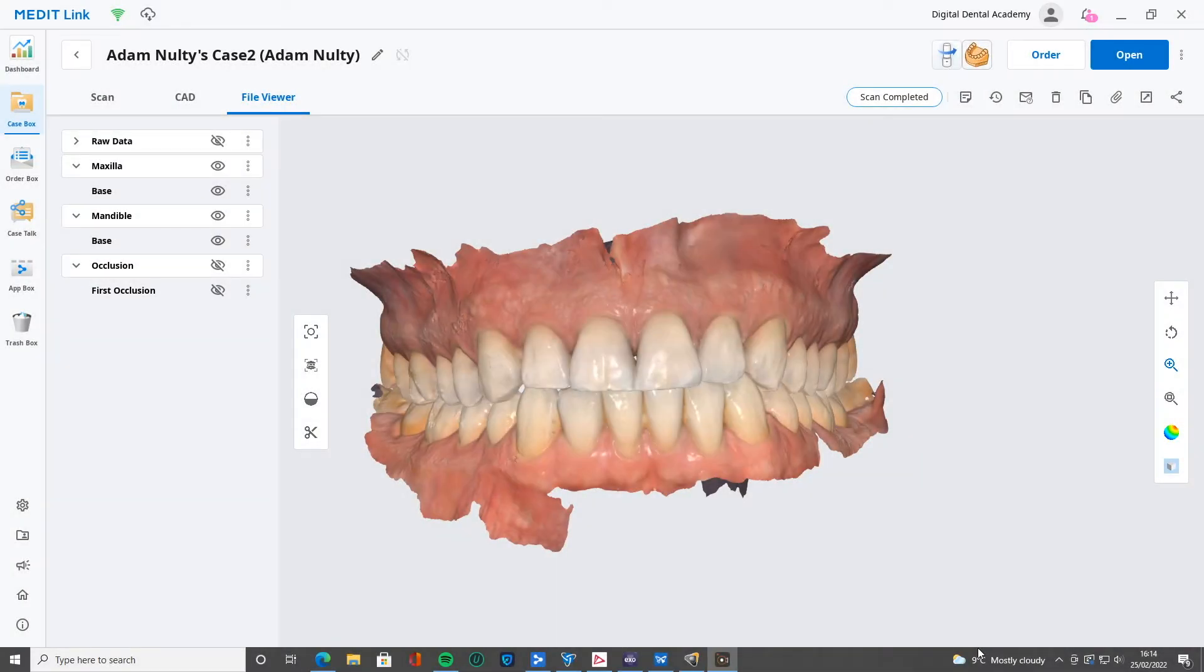Hi everyone. I'm going to show you the first of the apps we're going to talk about from MeditLink. This one is the Model Builder in MeditLink.